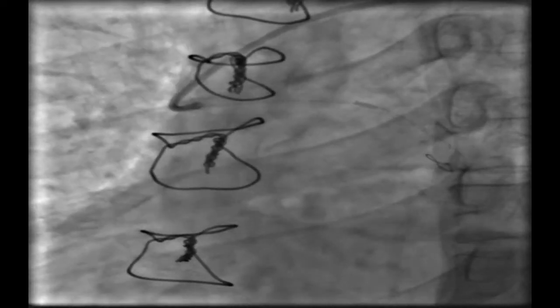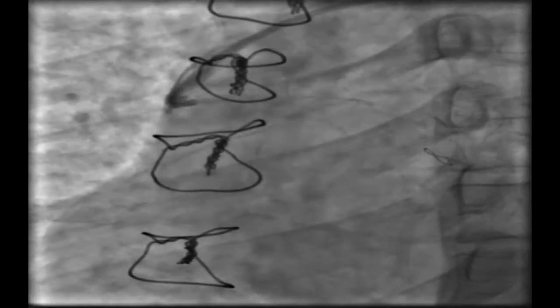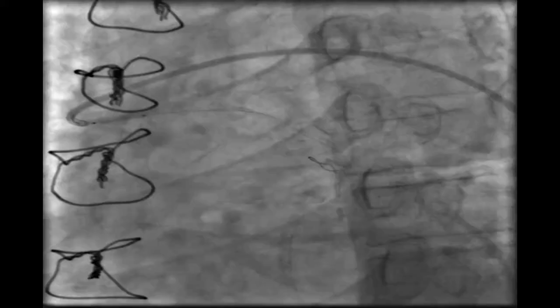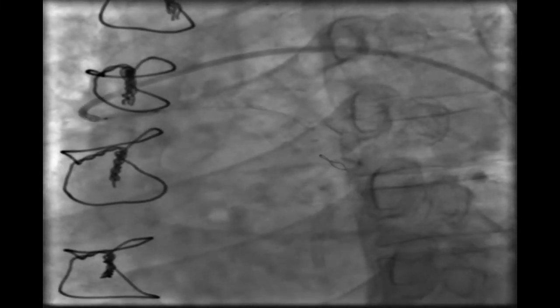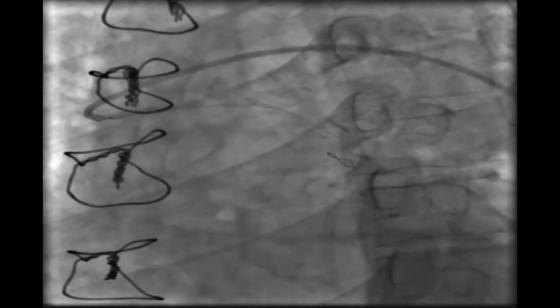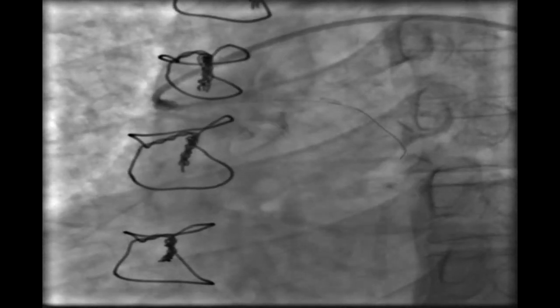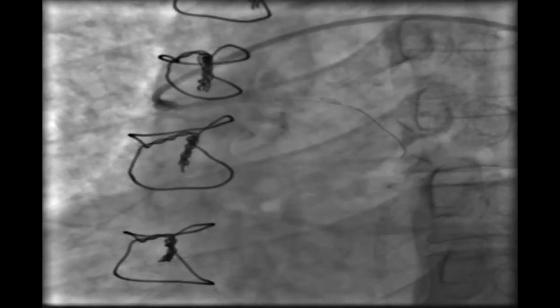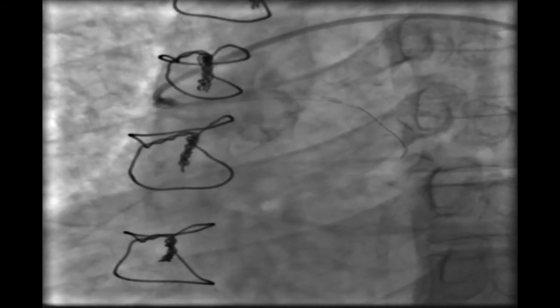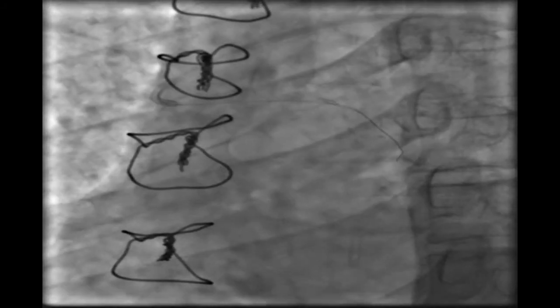Then we tried to open the saphenous graft that was occluded. We passed the wire — it passed easily. The PTCA balloon passed through the total occlusion and we inflated it at nominal pressure. But unfortunately, the graft did not open. We decided to leave the patient with this result and try maximum medical treatment, following up to see if he remained symptomatic.